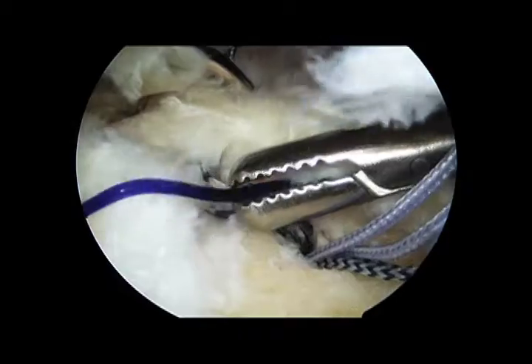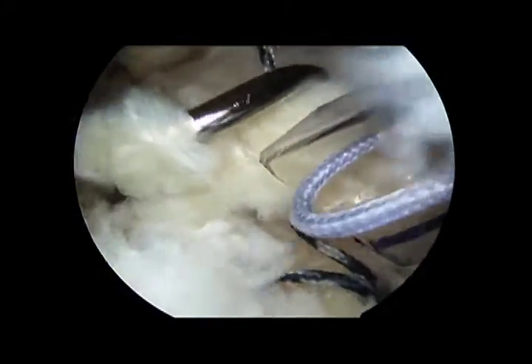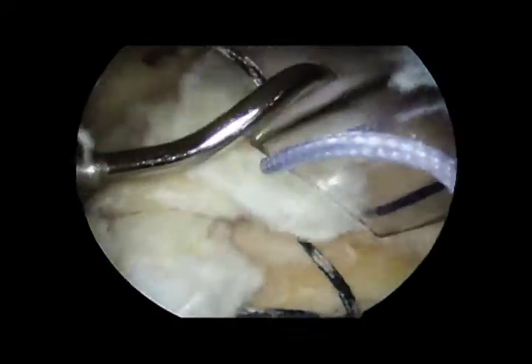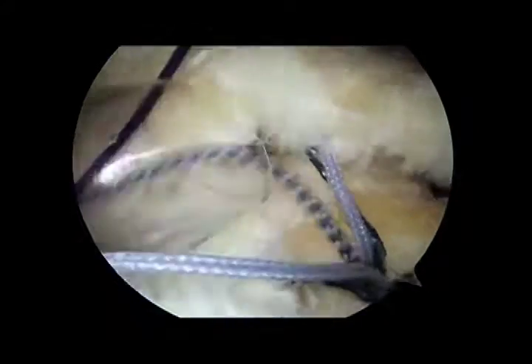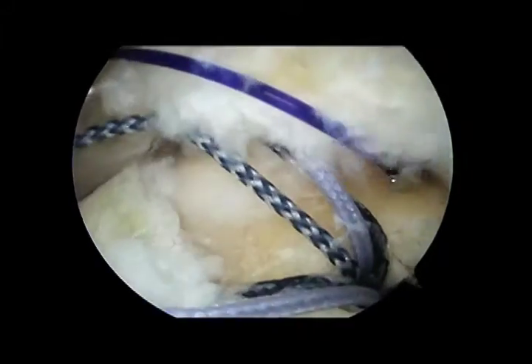Here we see the suture shuttling device pierce the cuff and send in another PDS, which is retrieved at the anterior cannula and used to shuttle the middle suture limb back through the cuff in a simple suture configuration. Not shown is the retrieval of the medial limb of the anterior suture at the posterior cannula. Here we see the suture shuttling device pierce the cuff from the anterior portal and send in the PDS suture, which is retrieved at the posterior cannula.